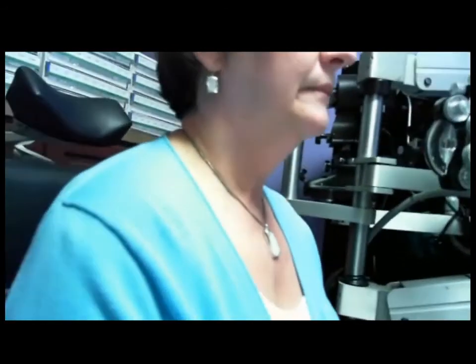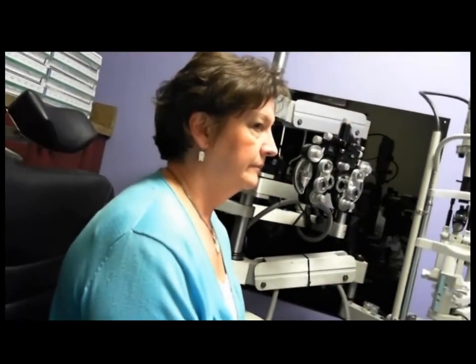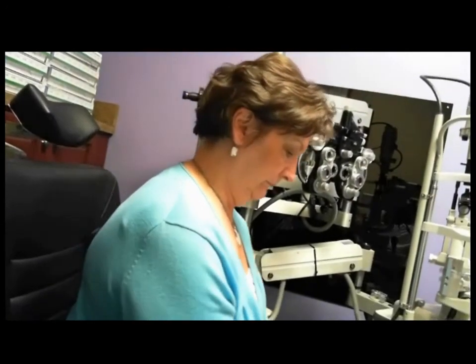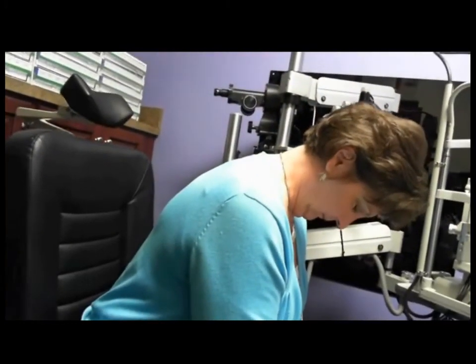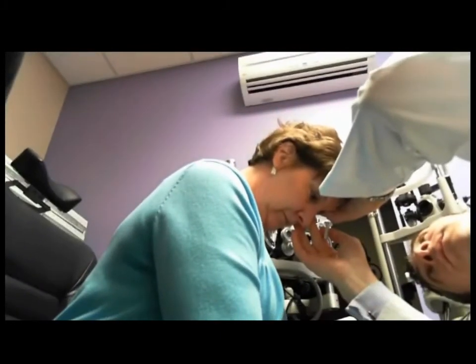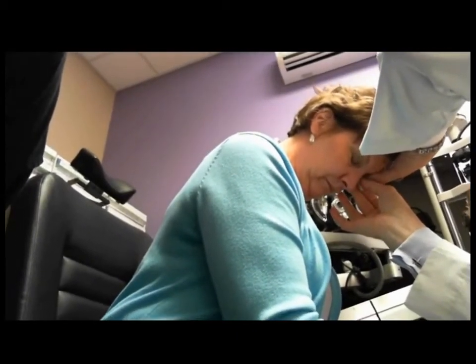And I don't see any air bubbles, so I think we did a pretty darn good job. All right, let's repeat this on the other eye. Now, we're going to do the same thing. Darlene, I'm going to have you lean over, tuck your chin down. Good. I'm going to come here, immobilize the upper lid, move the lower lid out of the way, and close.